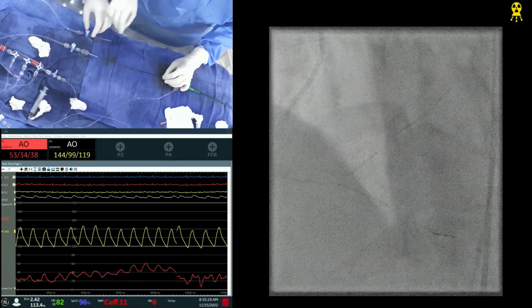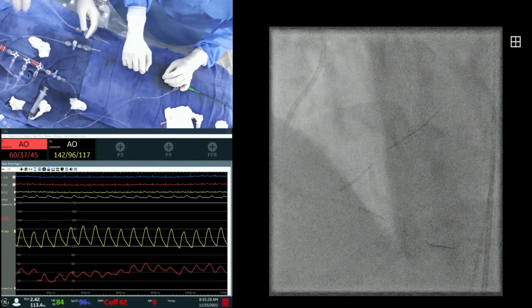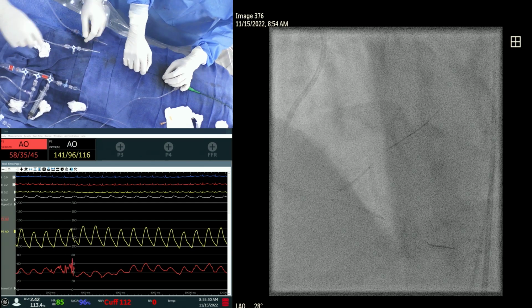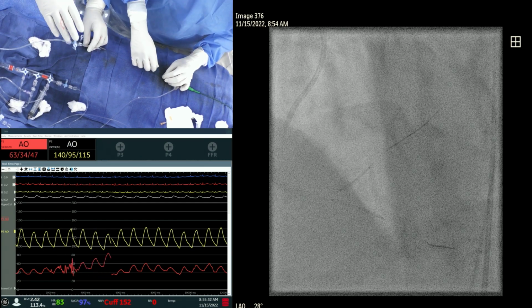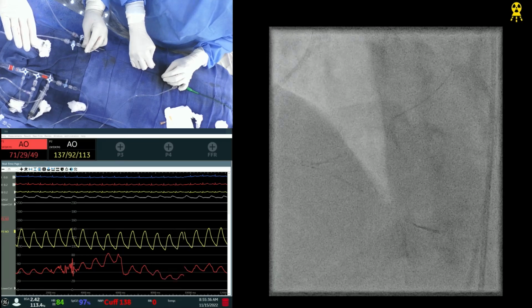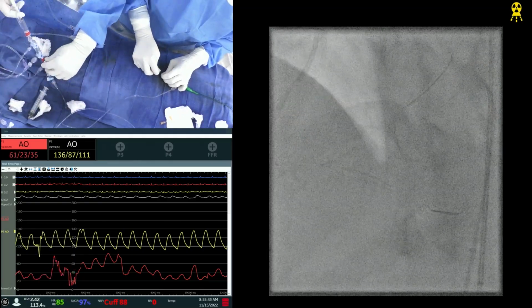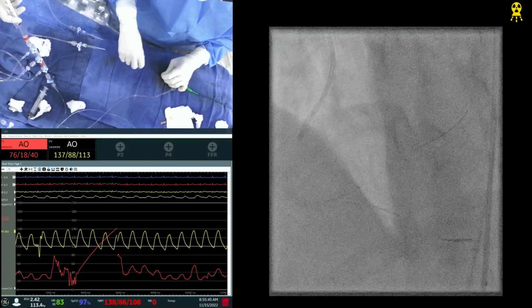Okay. Good. Let's pull back the PDA. It's the other way around. So AV first. No, I know. Crush. Pull back the PDA into the position. PDA has moved further. You mean the wire? The PDA stent. Yeah. Stent, yeah. But the thing is, now you don't know which is what. This is the PDA. Yeah, they're good.